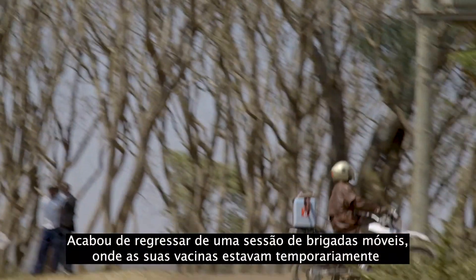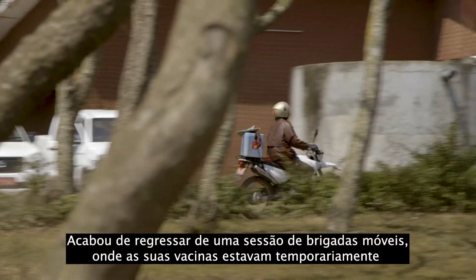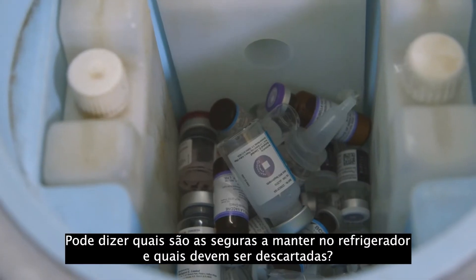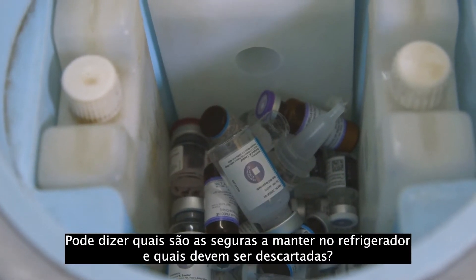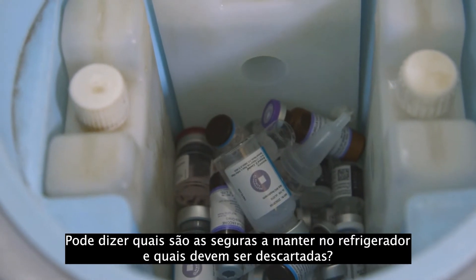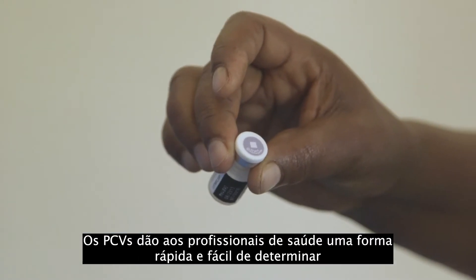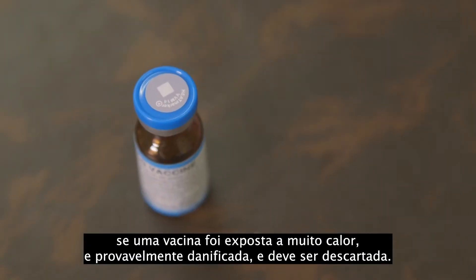You just returned from an outreach session where your vaccines were temporarily out of the correct temperature range. Can you tell which ones are safe to keep in the refrigerator and which should be discarded? VVMs give health workers a quick and easy way to determine if a vaccine has been exposed to too much heat and likely damaged and should be discarded.